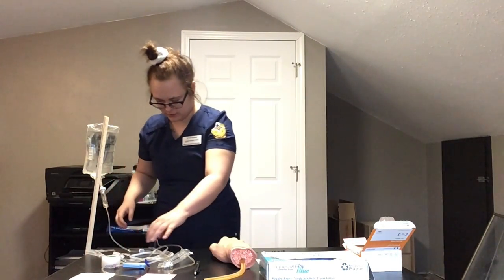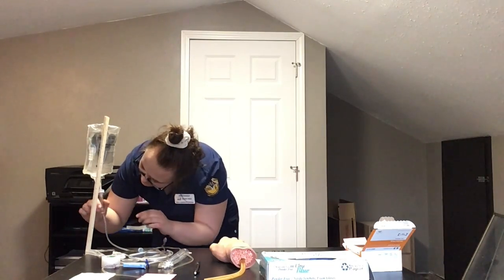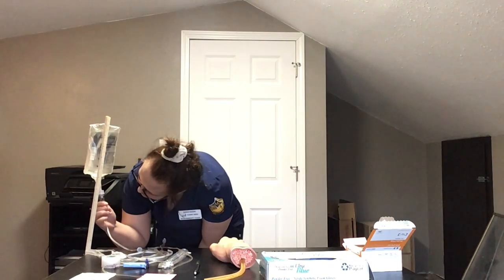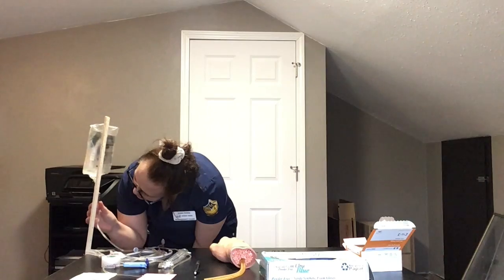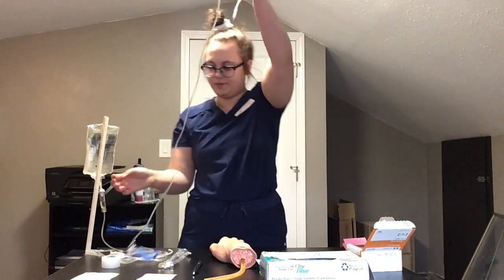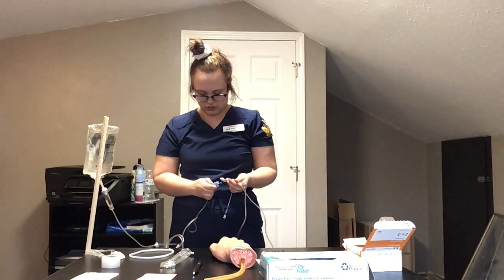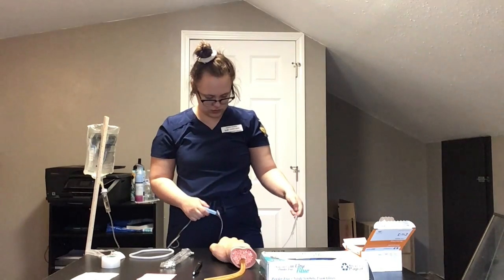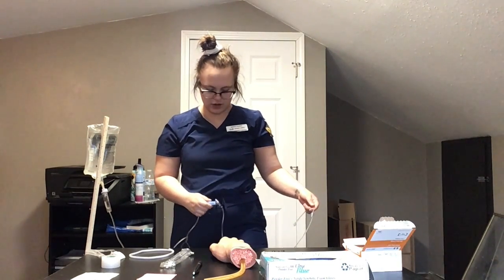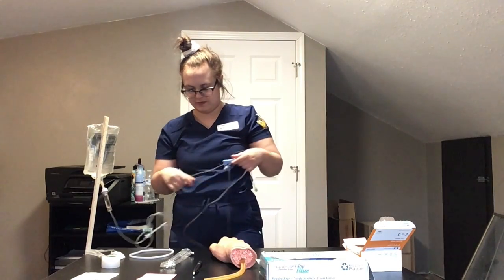So, now that that is hung, I'm going to squeeze this until it's halfway full of liquid. And then I'm going to prime my line. Okay, so my line is primed. I'm going to lock this again and set this aside.